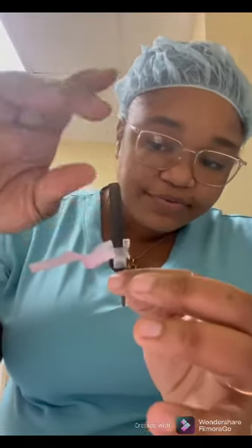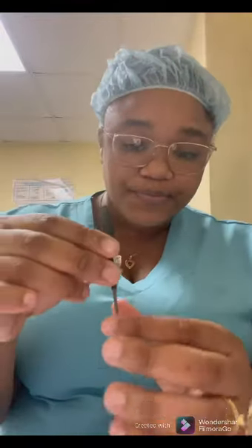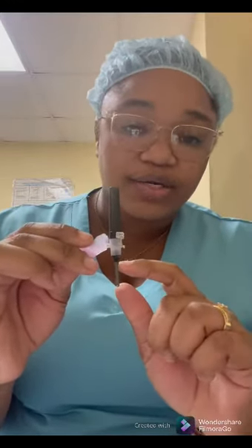At the bottom here, we have the rubber sleeve, and this has a needle under it. This is what you attach the rubber sleeve and the threaded hub. This is what you attach this multi-sample needle to the tube holder.